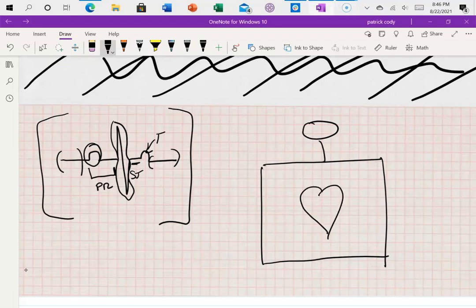So in the middle of the chest sits the heart, and then we typically have electrodes in these 4 places. Okay, so this is over here on the right arm, this is over here on the left arm, the left leg, and the right leg. Typically, the right leg electrode is a ground for this system and isn't going to really be involved in any of our monitoring of electrical activity. So from now on, we don't really need to talk about it.